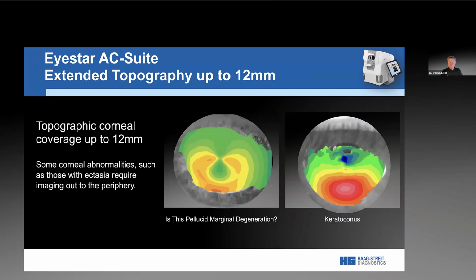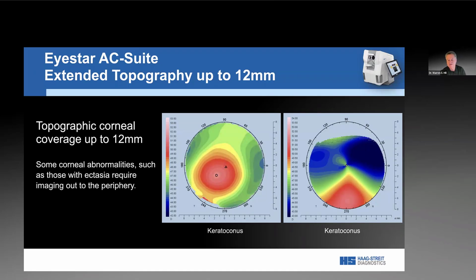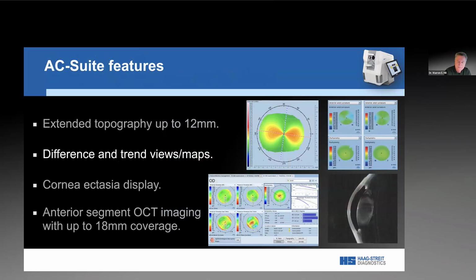And those of you who are cornea experts, often you get patients that come in with the pattern of the kissing dove or the lobster claw and say, well, I was told I had pellucid marginal degeneration. Well, we can image way out into the periphery, and you can look for that little clear area down below. And if you really don't see it, what they probably have is just a variation on keratoconus. Pellucid marginal degeneration is a pretty rare diagnosis. So most of these people have keratoconus, and here we can show it.